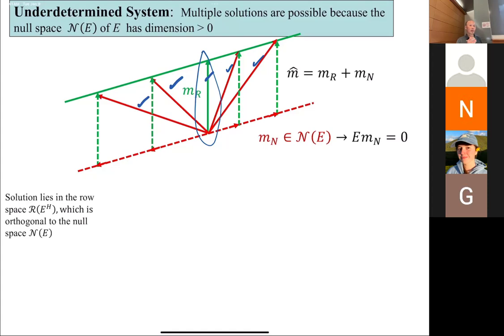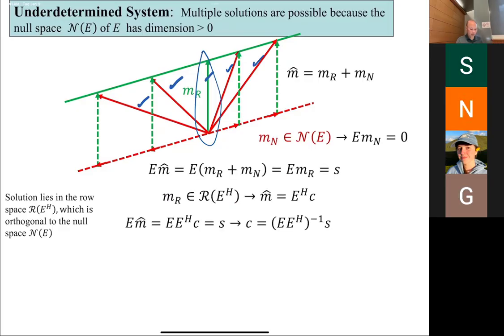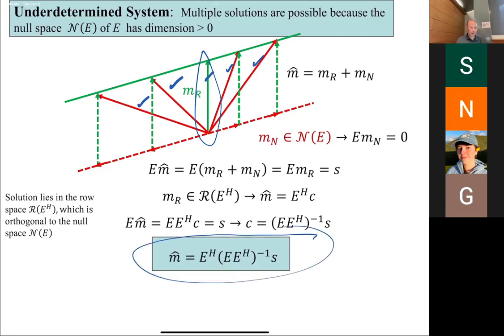So just know that if you take a Fourier image, Fourier space, and you just start getting rid of data and put zeros in where you got rid of data and take that inverse transform, you're essentially getting the minimum norm solution. And so we know that that leads to aliasing, right? So I can do this, but if I do this, I'm going to have aliasing, right? And that's generally not desirable. Okay.